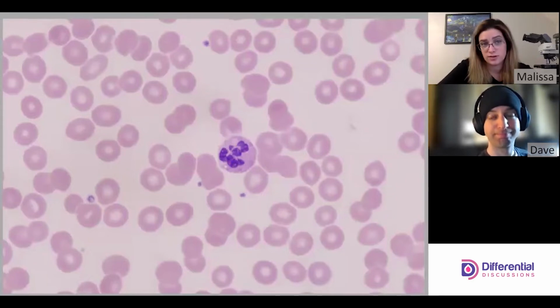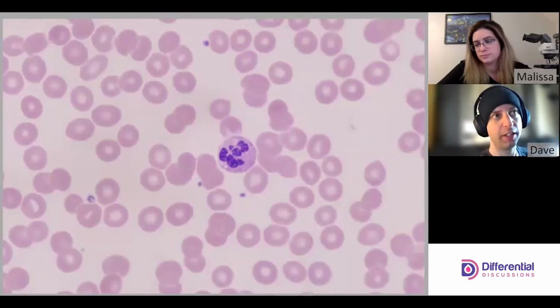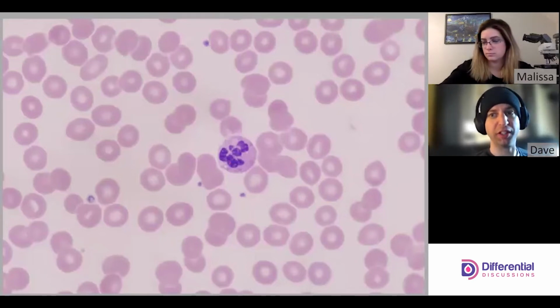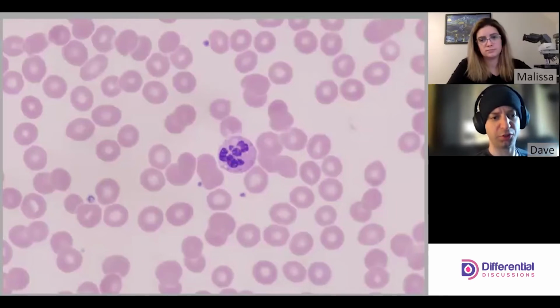They're still neutrophils. They have the same function. They just have a hypersegmented nucleus. So just qualitatively to make the distinction and call it, because it's possible you could come across one hyperseg, and we don't want to be overly sensitive to calling something when there's not a true megaloblastic anemia present. But yeah, hypersegs, they're cool.